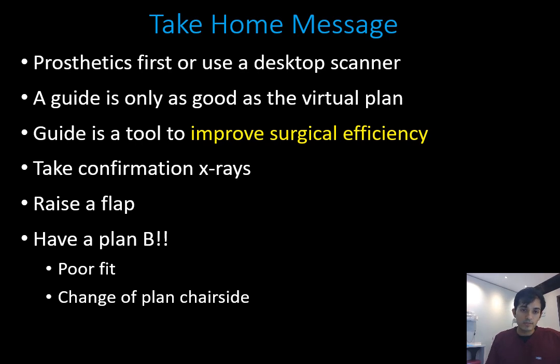Take confirmation x-rays. That's one thing I would say. A lot of guided kits I see don't have x-ray pins, so I actually have added those in myself. I still take confirmation x-rays. It's just good habit, good practice, good documentation to have to make sure you're drilling in the right place and not being completely reliant on the guide.